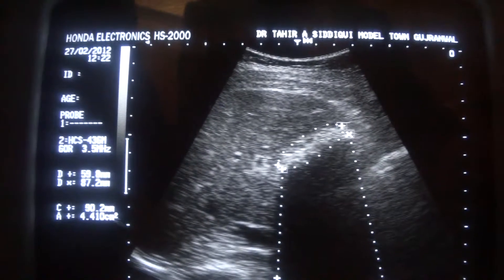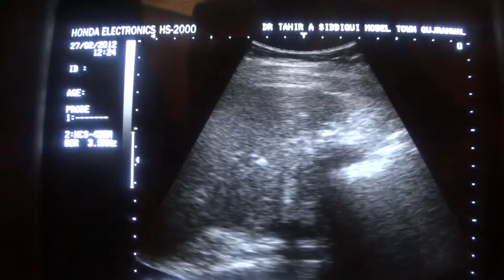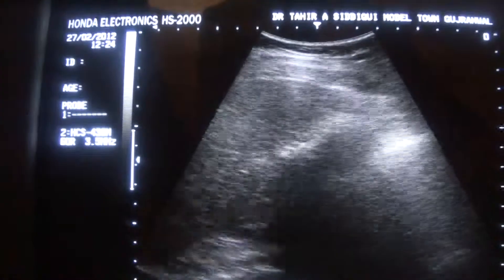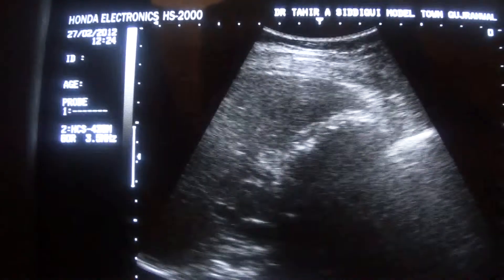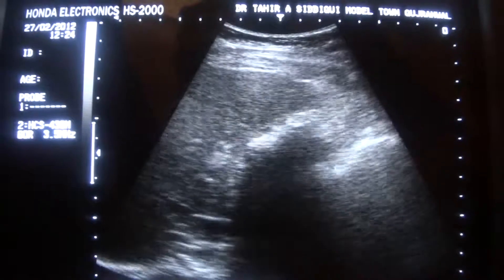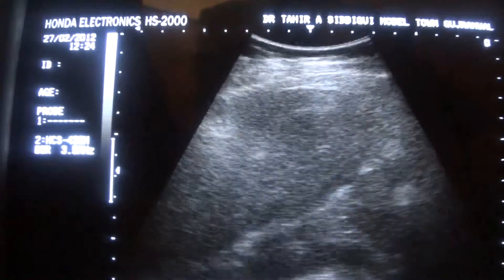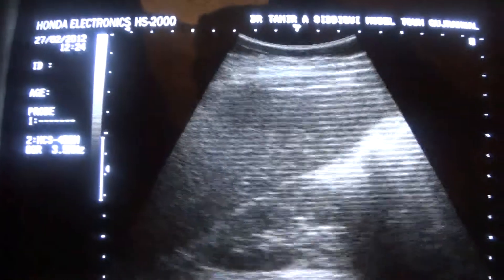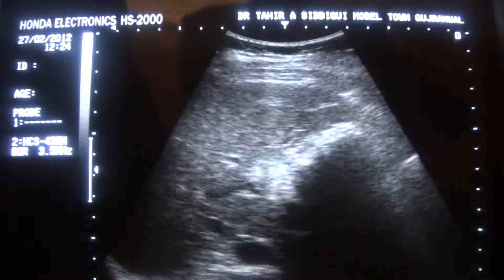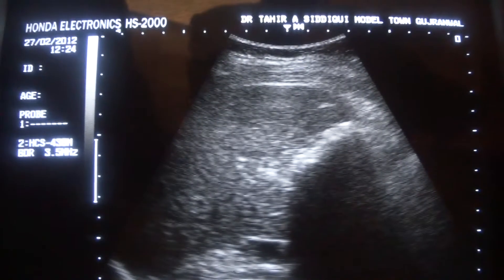But as I've always said, whenever you see such a structure, always give it a sweep and see whether it retains its shape or not. Give a sweep to it, or ask the patient to take a deep breath and hold it, then scan from the subcostal margin.